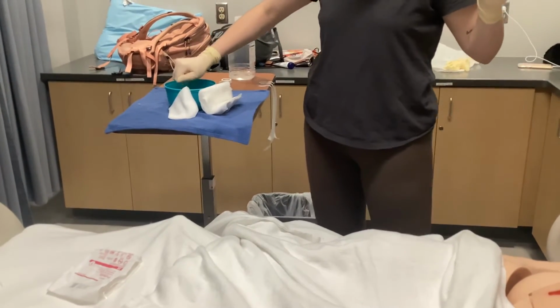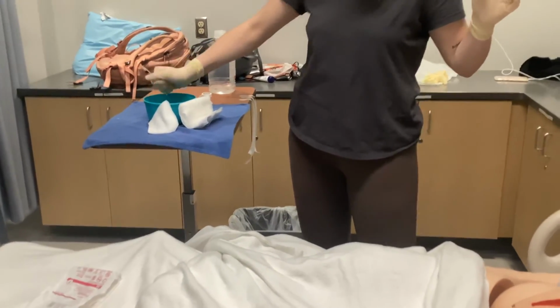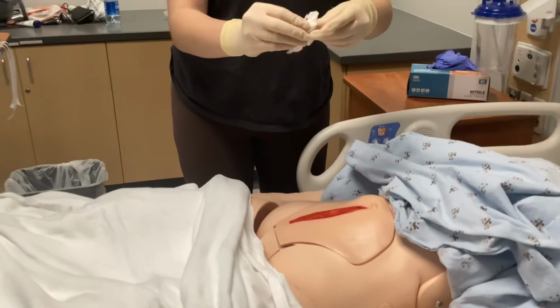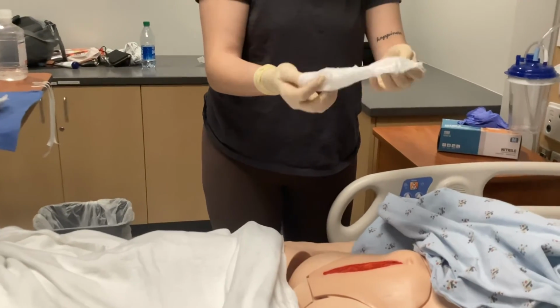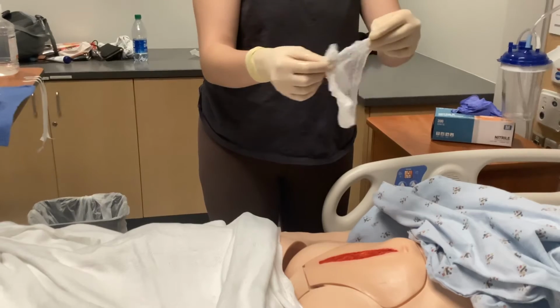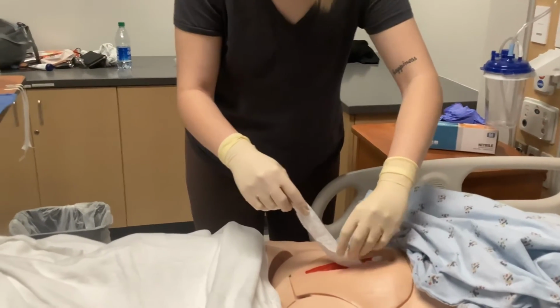Now this is a wet to dry dressing change. Now I can do an accordion or a zigzag procedure. I'm going to do an accordion style for this video. I can either pack it with my hands or the pliers that are provided. All right, Mr. Jones, please keep breathing for me at this time.